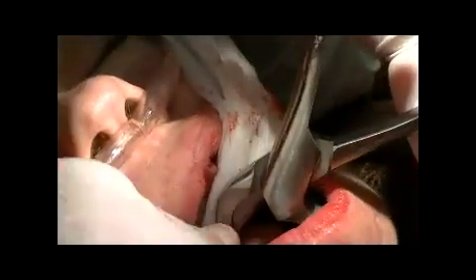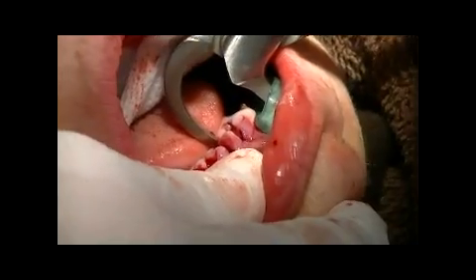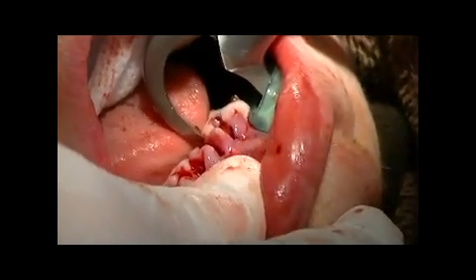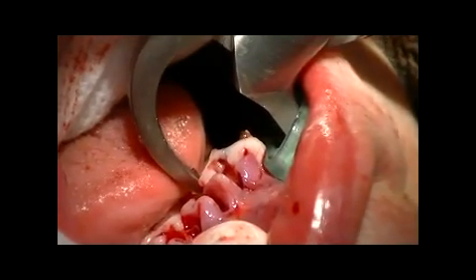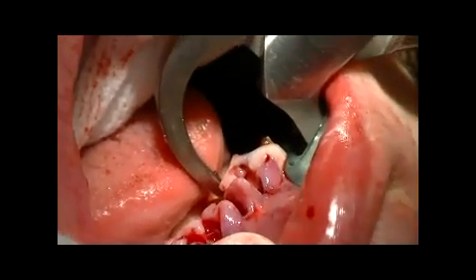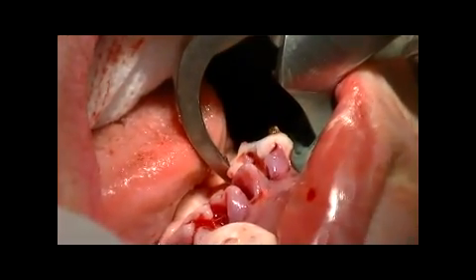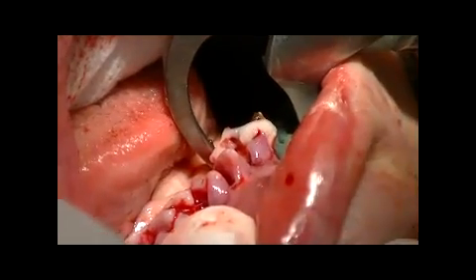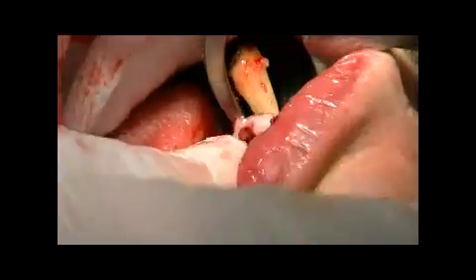The cuspid — very, very badly broken down — trying to engage that lingual plate, lingual portion of the tooth, and rotating my wrist. No arm pressure on a cuspid tooth. This would be a very, very difficult extraction using conventional techniques. But you have to take your time. A minute or two is a long time for us dentists. Did you see that? That just popped right out. Wow.